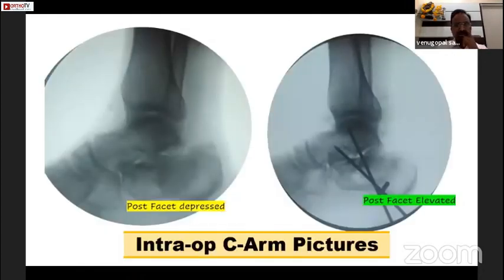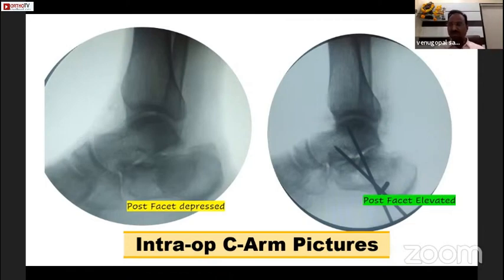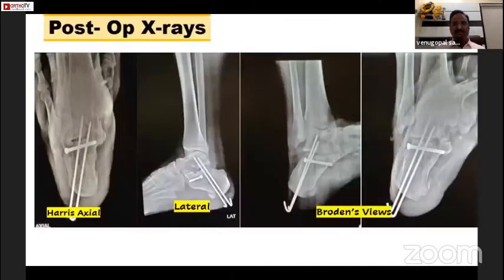These are a few intraoperative pictures. Here we can see the posterior facet has almost gone down, and after elevation it sits nicely on the inferior surface of the talus, which acts as a template. As Dr. Sampat said, whenever you feel ready, you pass the K-wire along the direction — whether it is toward the middle facet or medial facet or posterior facet — accordingly. Once confirmed, we pass a sustentaculum tali screw.